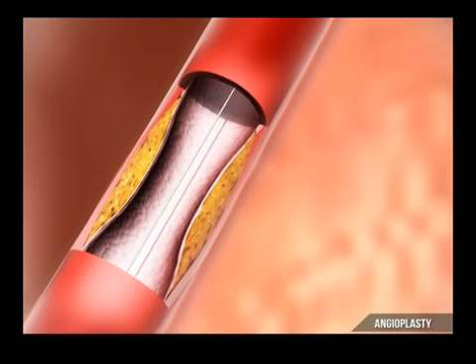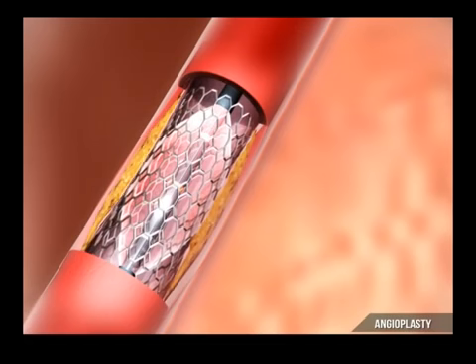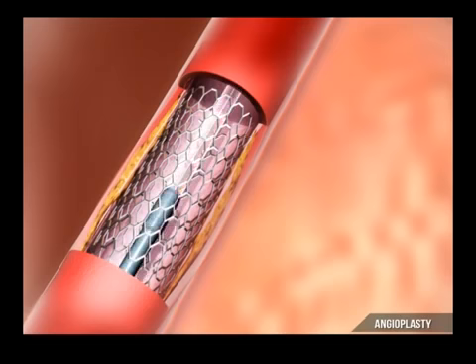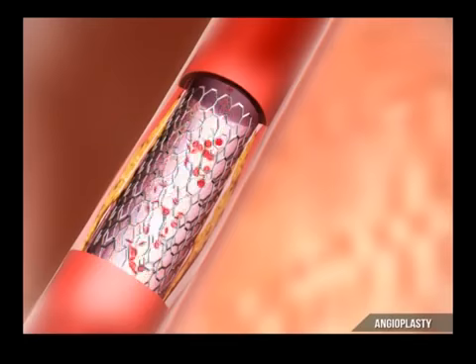The stent-carrying catheter is advanced through the artery to the site of the blockage. The balloon is inflated, causing the stent to expand and fit on the inside of the artery. The balloon is then deflated and the catheter withdrawn, leaving the stent in place. The stent is left in the blood vessel permanently to keep it from closing up again.